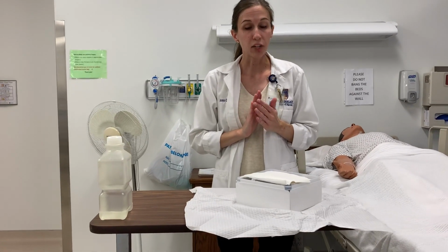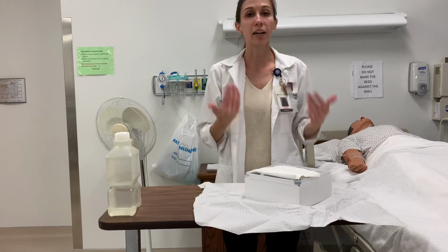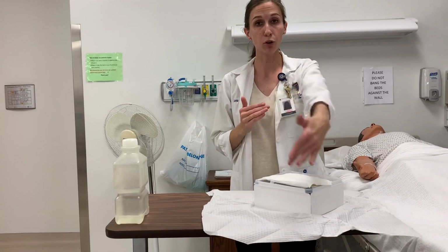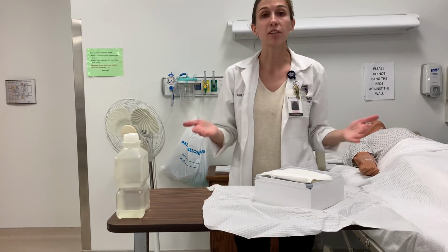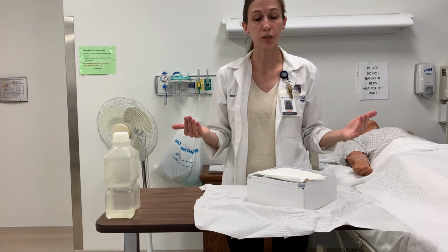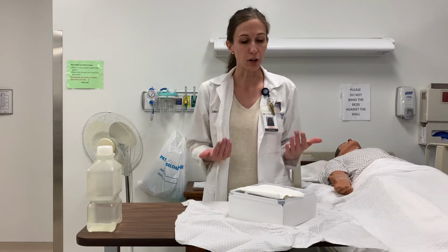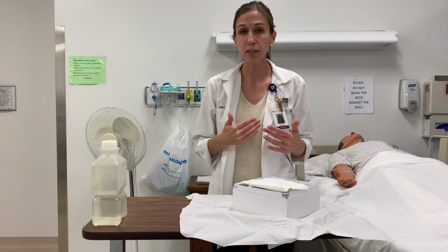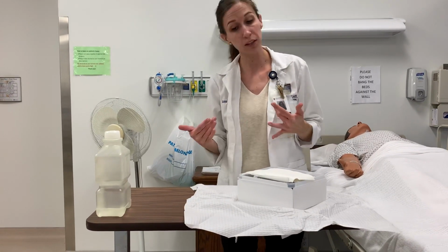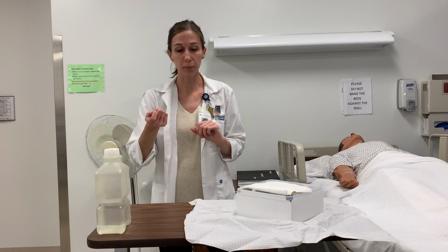So again, I have to make sure that I never turn my back on this, because if I turn my back, I've now broken sterility. If I cross over my field to grab something, I've now also broken sterility. If I leave this open and unattended for too long, I've now allowed bacteria to be exposed to this kit, so it's also no longer sterile. If I have anyone hand me something that maybe wasn't in my kit or I didn't bring with me, they can drop it onto my sterile field, or they can open it up for me on the side so I can grab it.